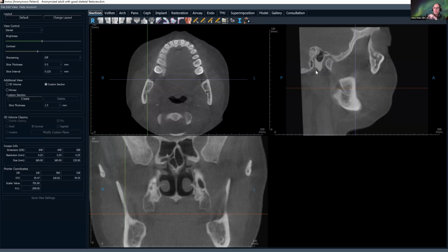It immediately travels through the parotid gland. And this is very important because if there is a parotid gland tumor, it can travel through perineural tumor spread up this canal. So this would be enlarged. I've seen it before, but not in any of the patients that I've come across. So I'm going to look at this canal and foramen right here.